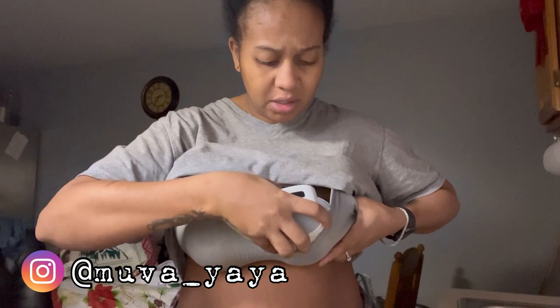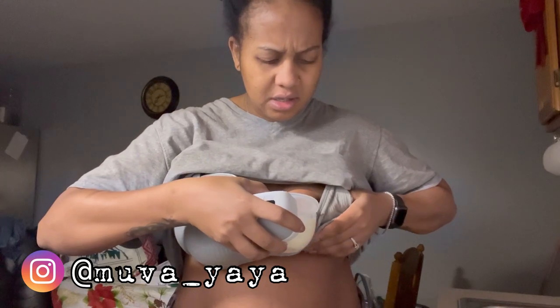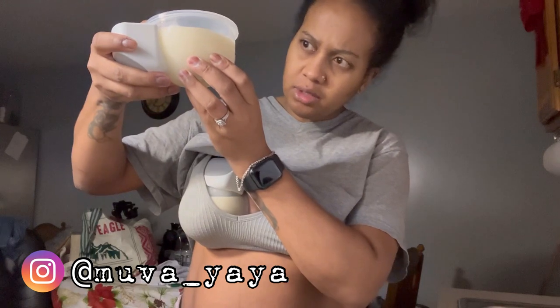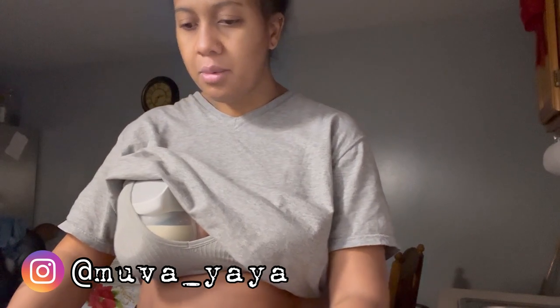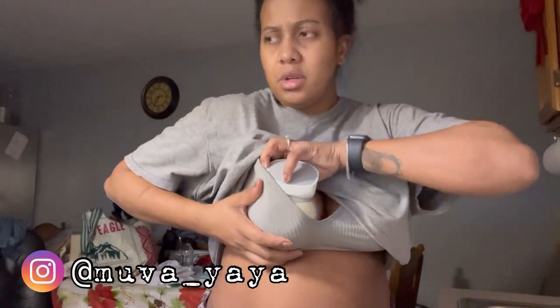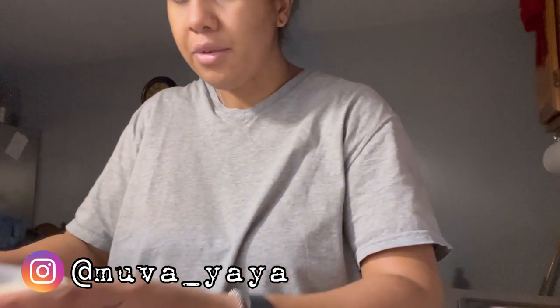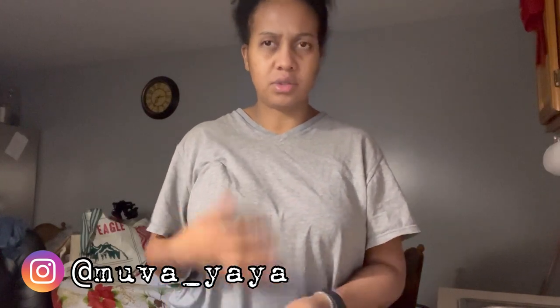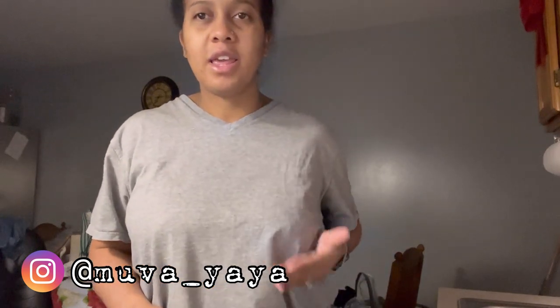Left boob — eight ounces... six ounces. Can I put this down without spilling? Perfect. Right boob should be six also, there's a lot of milk there. This boob I usually get anywhere from eight to ten ounces, sometimes eight to twelve — so this is my big producer. This one's feeding the baby; the other one shows up when it wants to.